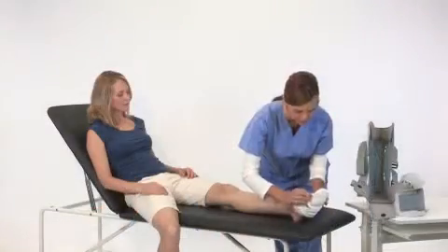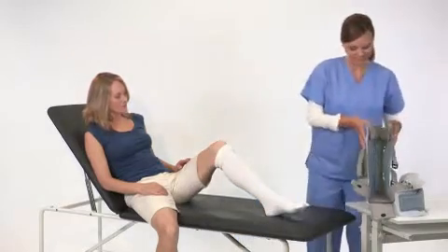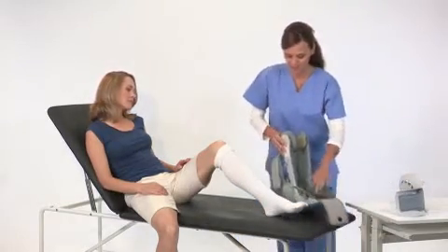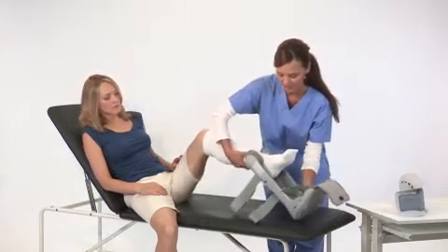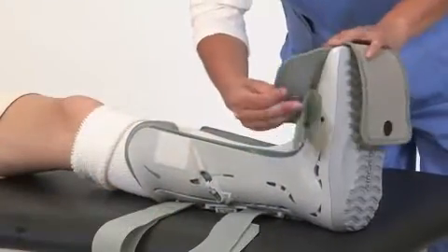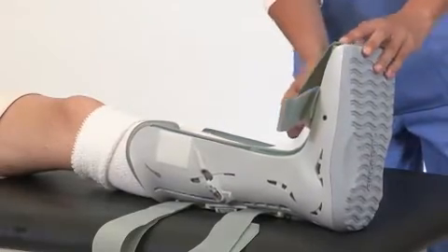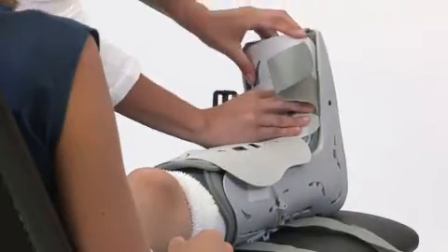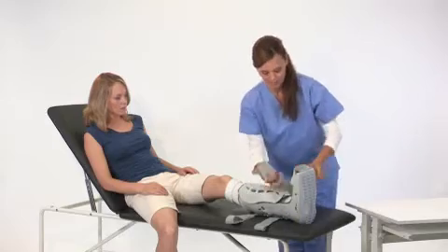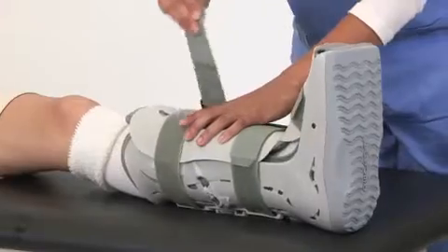First, put on the sock. While seated, place your leg in the brace and position your heel on the back of it. Next, wrap the foot flaps over your foot and the toe cover around your toes. Secure the front panel with the lower part inside the brace and the upper part outside the brace. Secure the straps from bottom to top, tightening them so they are snug and comfortable.